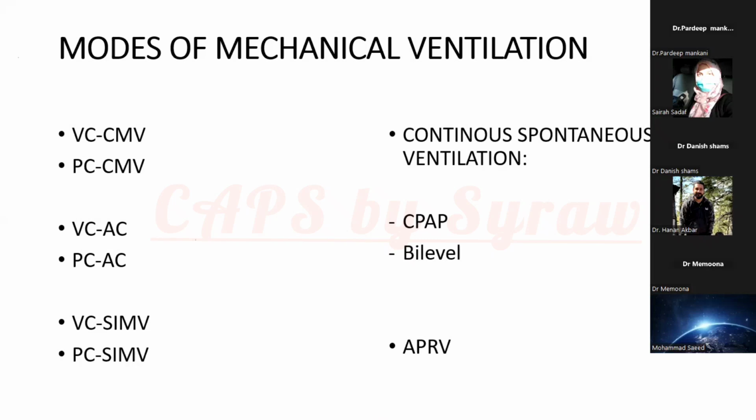Yes. So, sir, this PRVC mode has two subsets of modes. One that you have mentioned is SIMV, the other is assist control. So it has two subsets of modes.